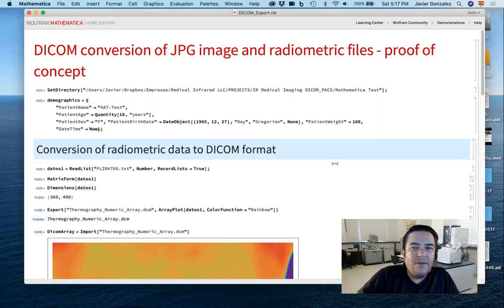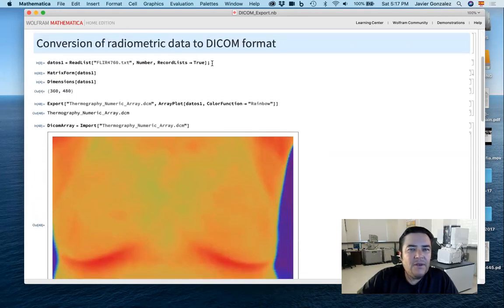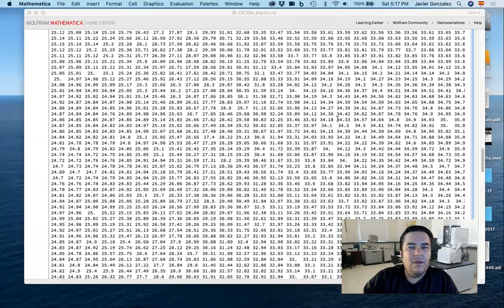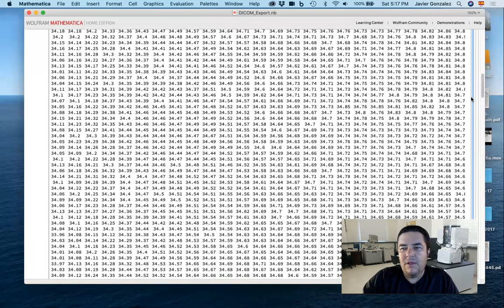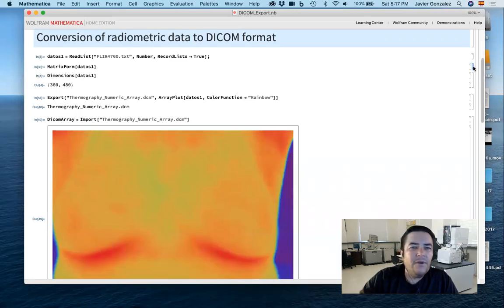So here's what I did in Mathematica. I converted a JPEG image, a radiometric and non-radiometric image, into a DICOM file. You can put the demographics here. They're also part of the DICOM file. And here's the temperature information, stored in this variable. You can see the temperature information here. Let's see, it's loading. Well, we don't need to see all those numbers. That's in degrees C. That's why it's 35, 32.